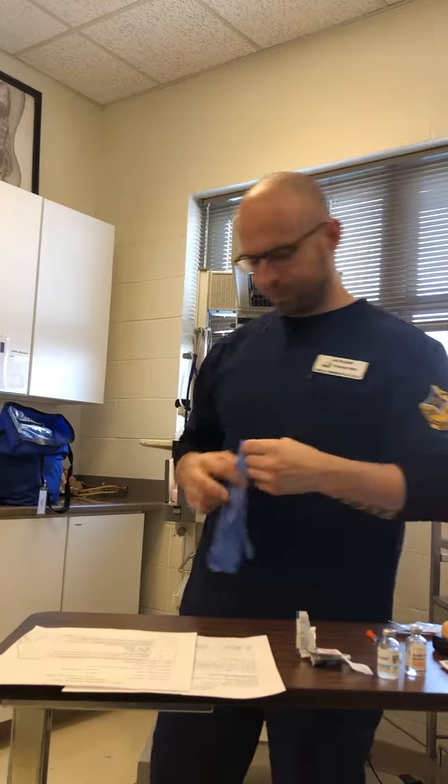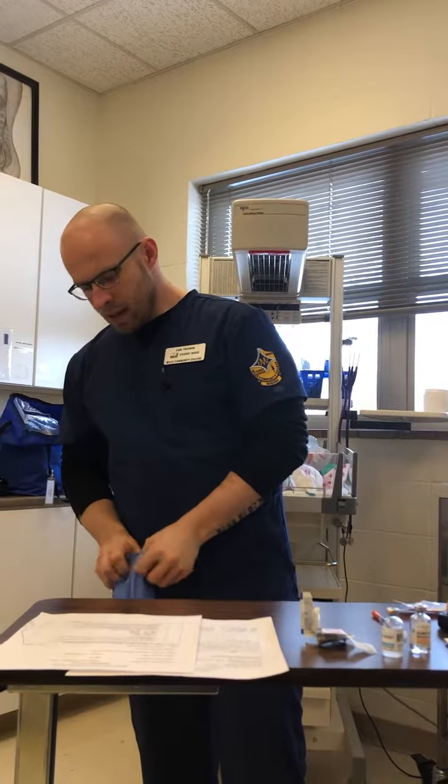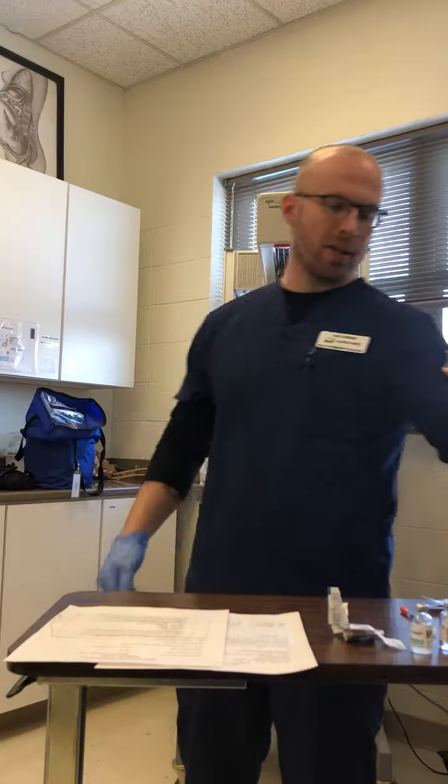We're going to enter the patient's room. We're going to wash our hands and apply gloves. We're going to talk to Mr. Rocker, and we're going to ask him for his name and date of birth. This will give us 2 patient identifiers that we need to verify that we have the right patient that is going to receive the medication. We're going to ask if he has any allergies. It says in his chart that he's allergic to Celebrex, so we're going to verify that and ask him if there's any more.